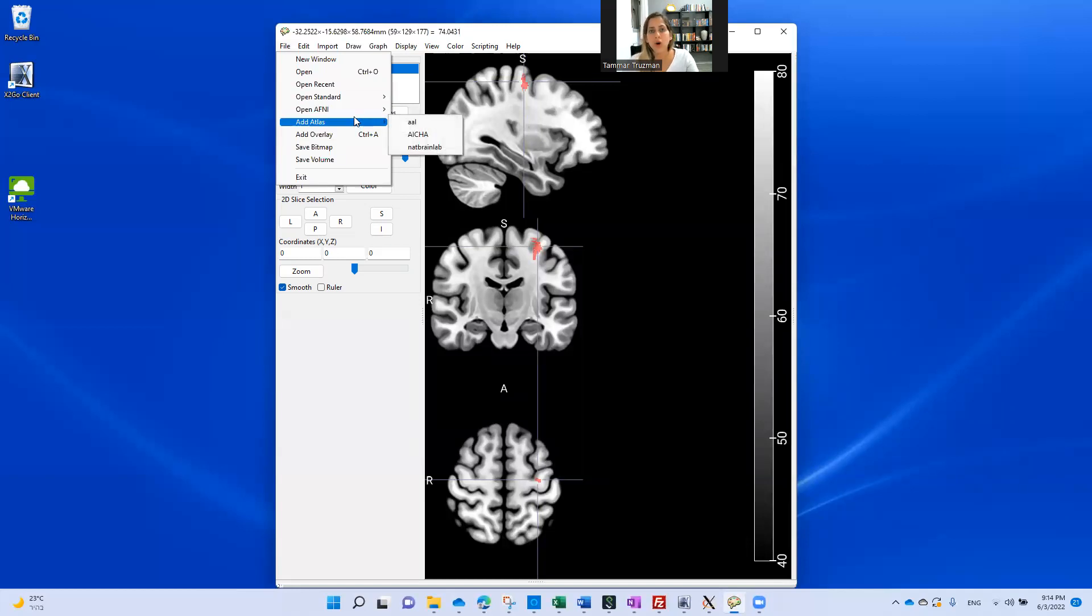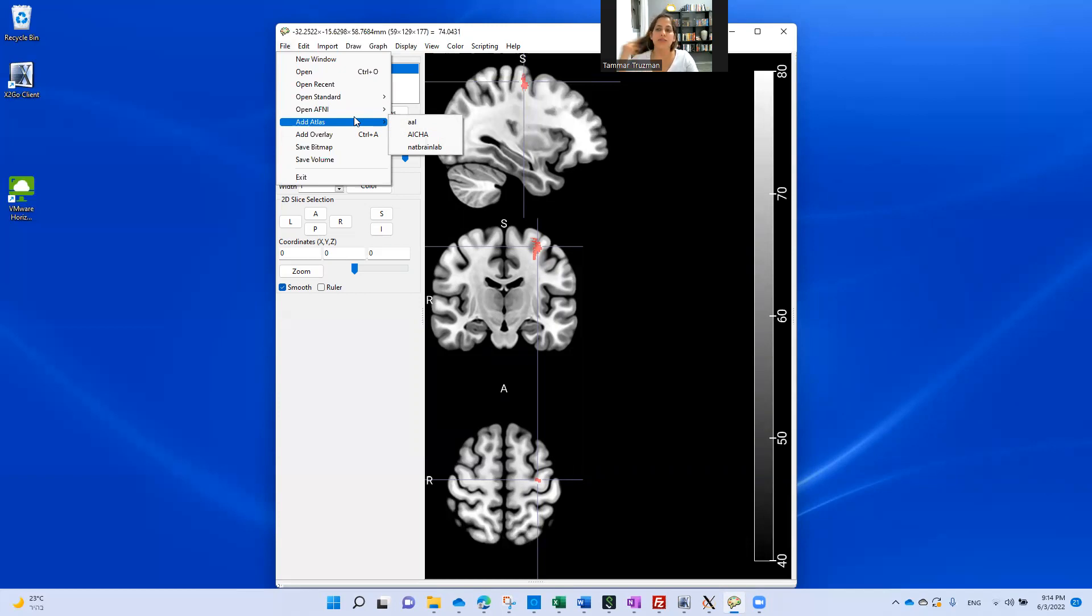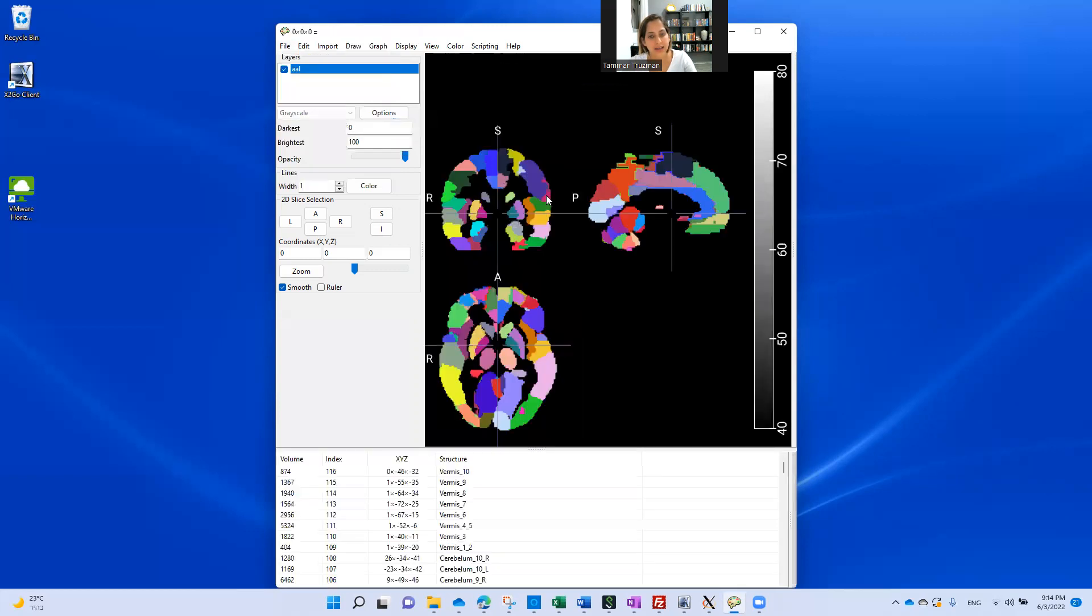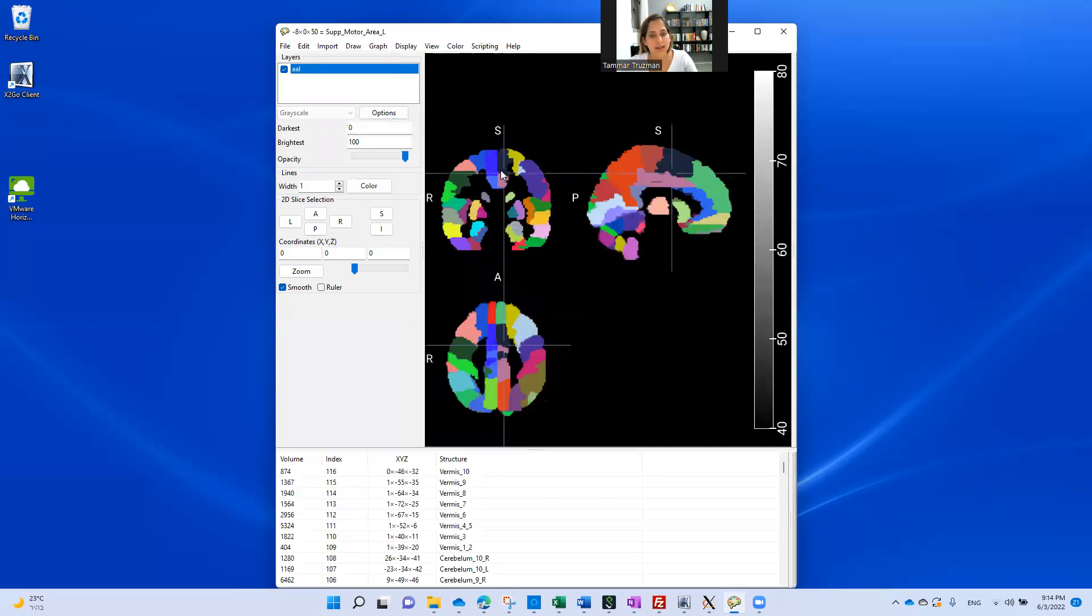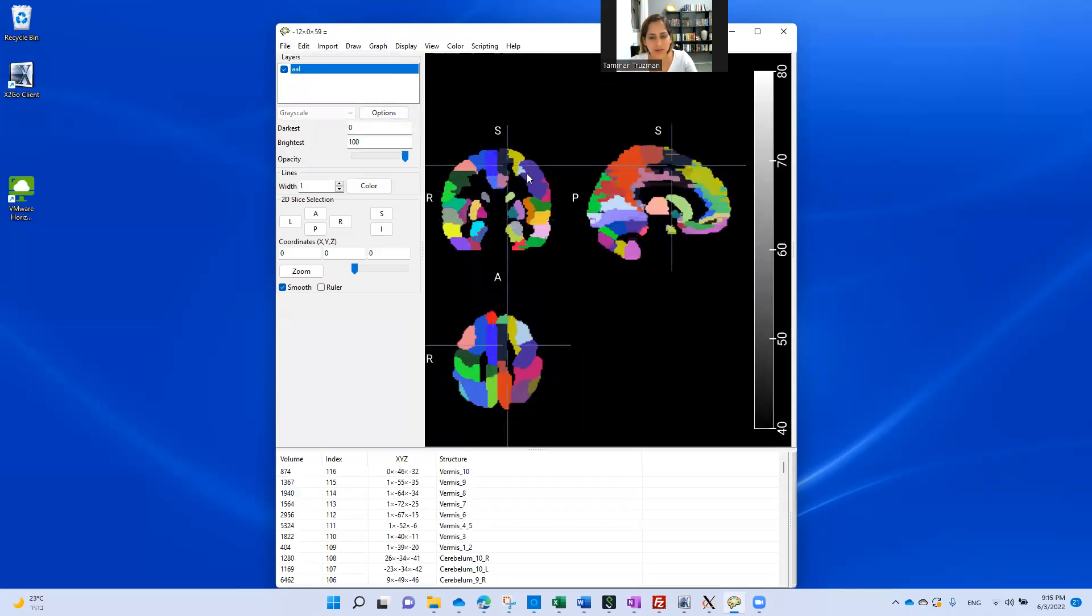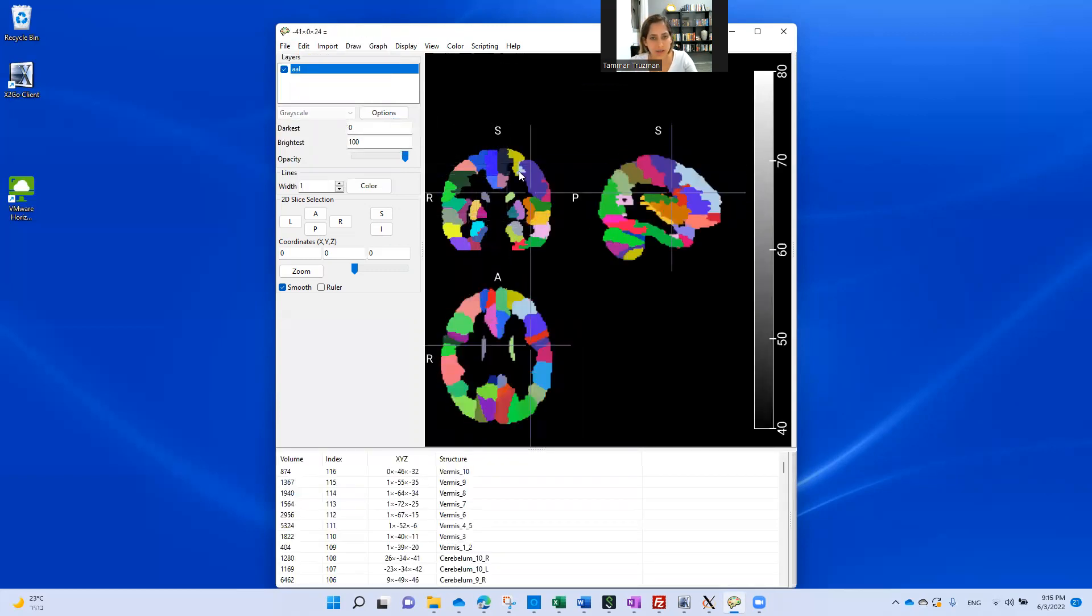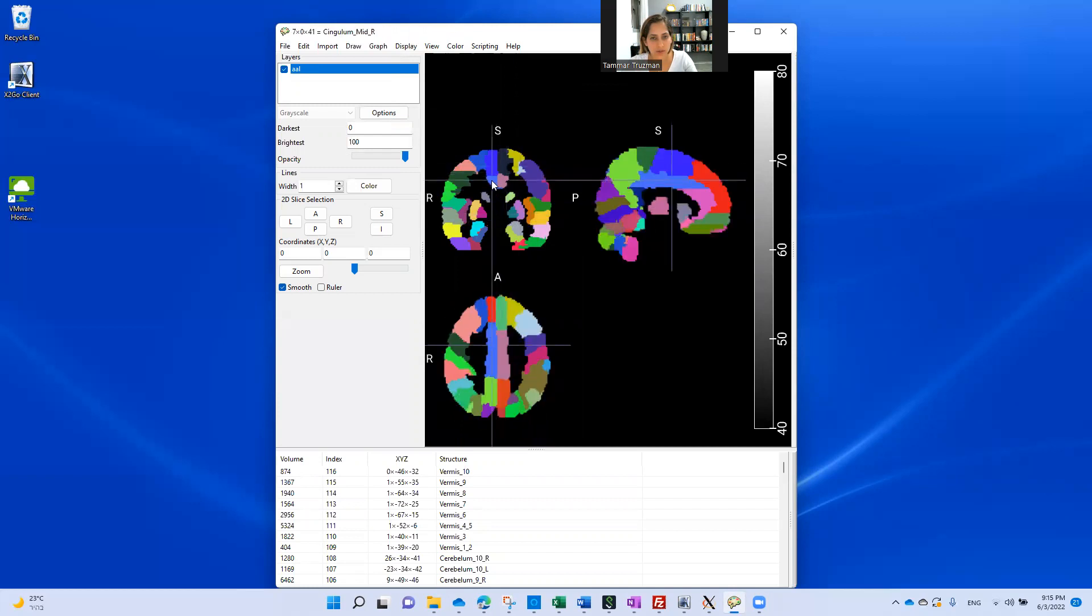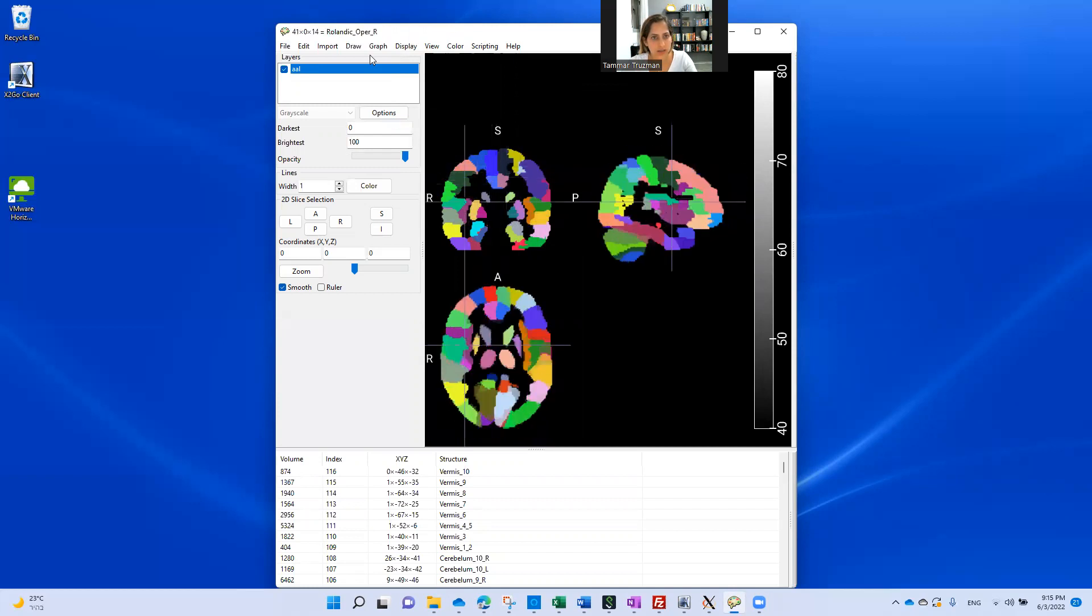Telling me exactly the specific regions by names, anatomical regions. So holding the control key down, I press atlas, A, L. And now I can just move with my cursor on the brain, and you can see here the anatomical labels.